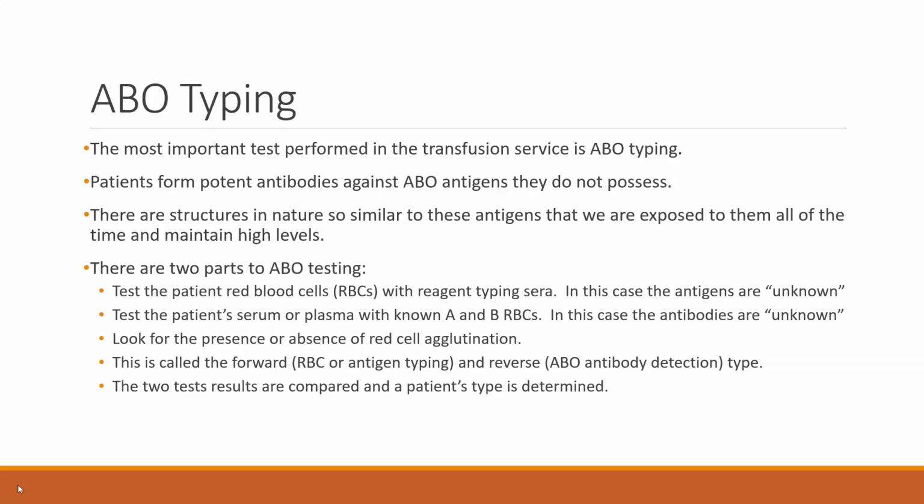With the exception of newborns, because they're not making antibodies yet, you must perform the forward and reverse. ABO discrepancies are not that uncommon, so you may have to do additional work to determine a patient's ABO type.